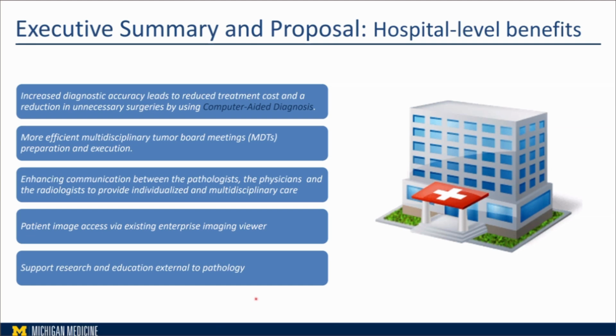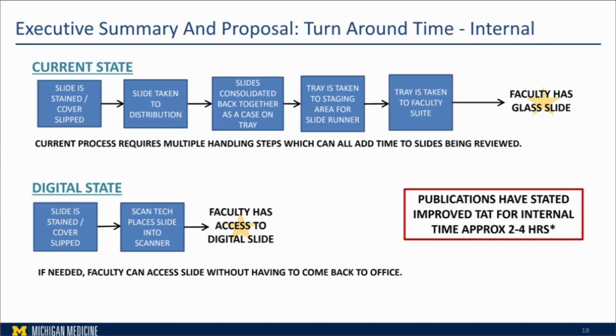Same thing also, collaboration and research between clinician and pathologist, and making patient image access available in the future. We're not doing it right now, but this is one of the opportunities that you can give, for example, a gallery to the patient, just like radiology.